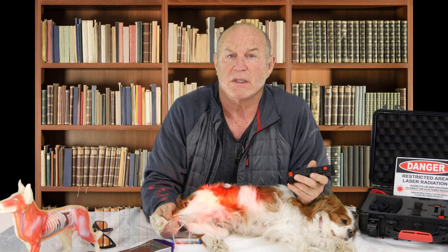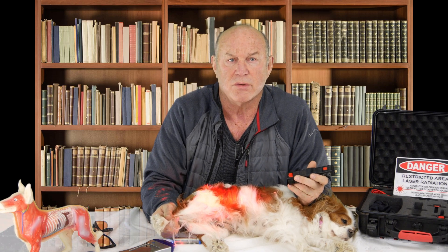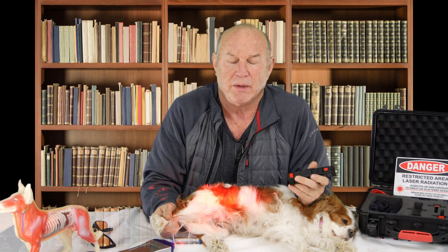With a combination like this, we're able to treat about 90% of these animals. If you're sending this condition down the street to a boarded surgeon because you don't do the surgery anymore, you're probably losing that client, according to the American Animal Hospital Association. By the way, these applications are also applicable to the human knee, and I've treated several with good success. There are also many other frequency sets for knee inflammation in this device, and there are 900 frequency sets specifically for human beings in it as well.